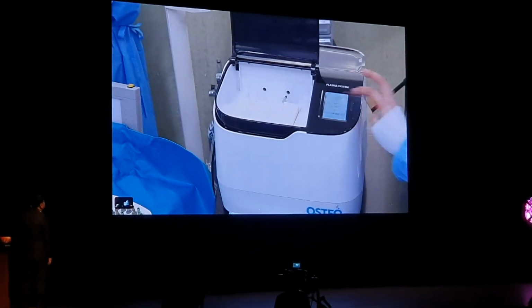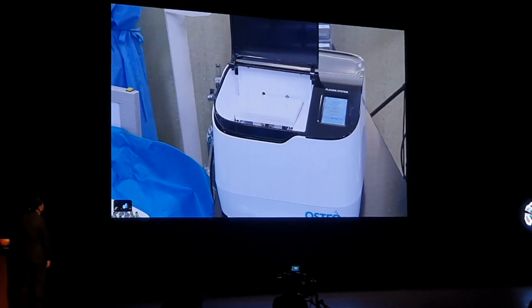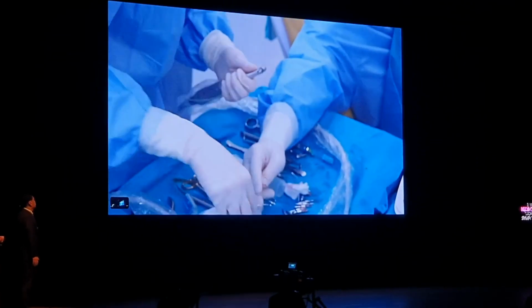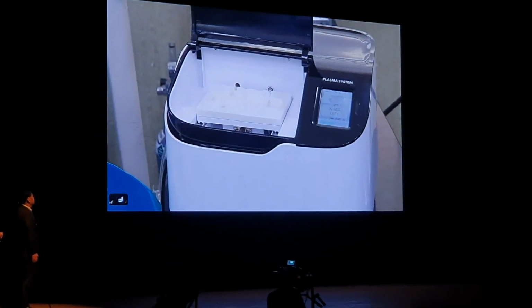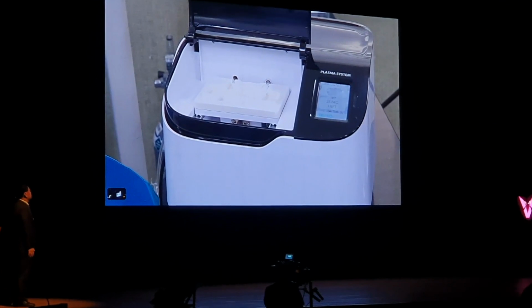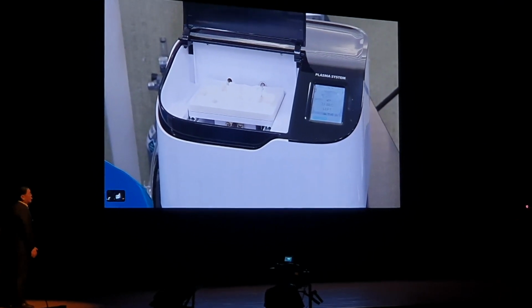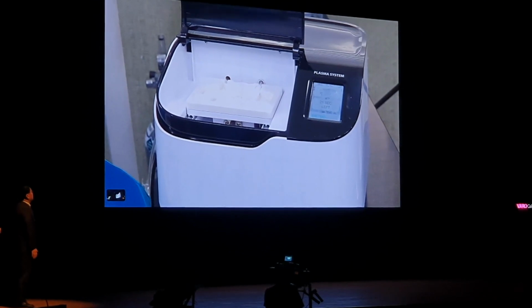If VARO guide has not been launched today, I'm sure this device would be the main focus on the symposium. This afternoon, Professor Jae-hoon Lee will talk about this implant surface activation in his lecture. You're looking at the osteoactive process occurring inside the plasma system.